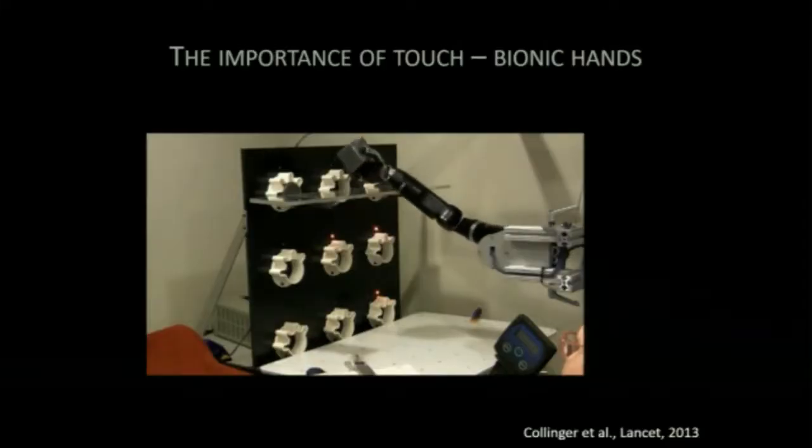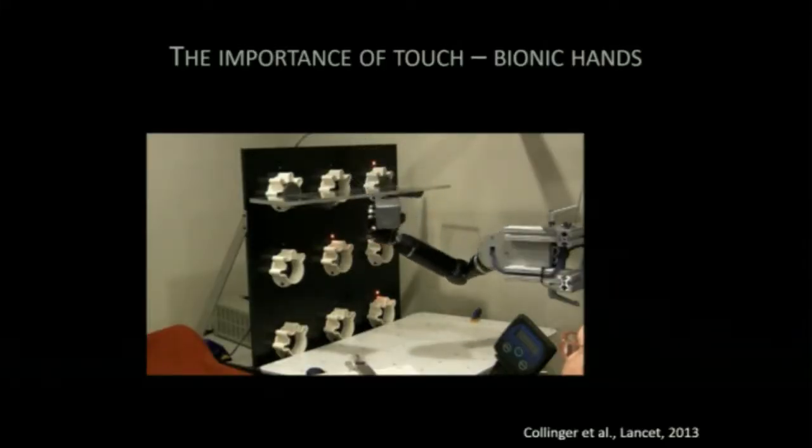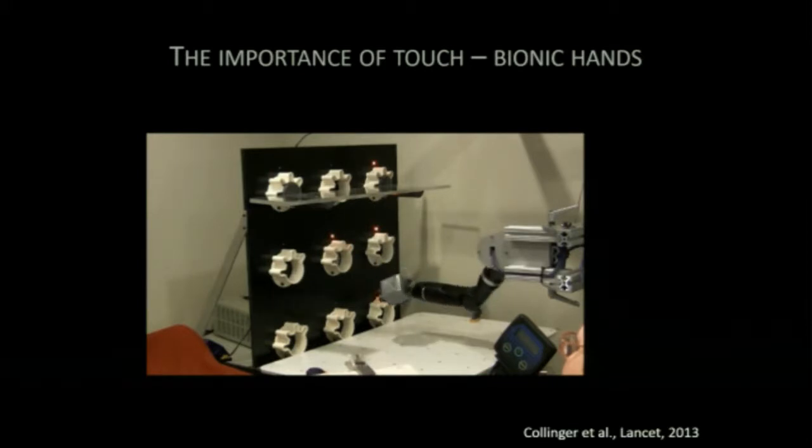The idea is when you move your arm one way, there's one pattern of activation. You move your arm another way, there's another pattern of activation. And they can look at these patterns of activation and infer what the subject wants to do, or the patient wants to do, and can move the robotic arm, right? And I'm not gonna spend a lot of time talking about that because that's not the focus of my talk. But the point is, if she volitionally tries to move her arm in a specific way, there goes the robot, right? And so she can control this robot by thought, and if you're seeing this for the first time, which I doubt any of you are, you're like, wow, that's like an amazing scientific and technological achievement. This person can control this extracorporeal device with her mind and can do so pretty adroitly.